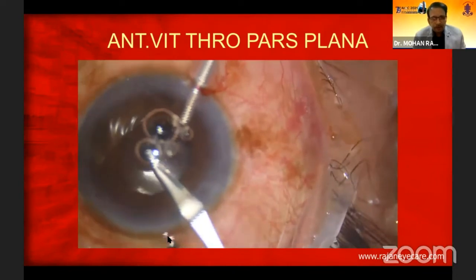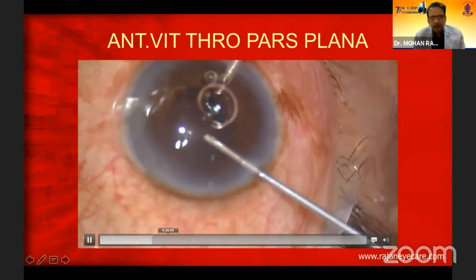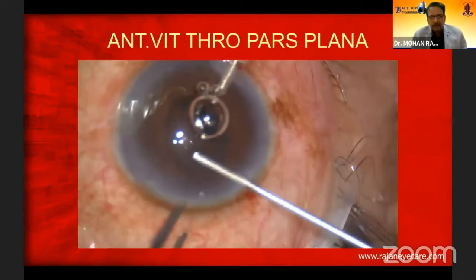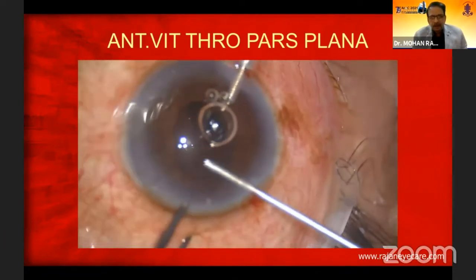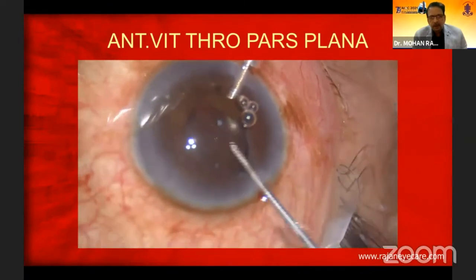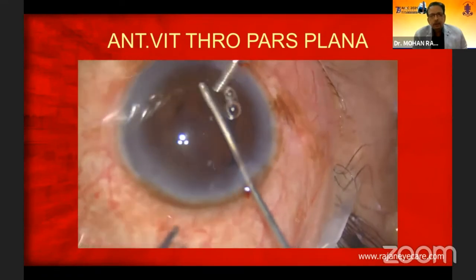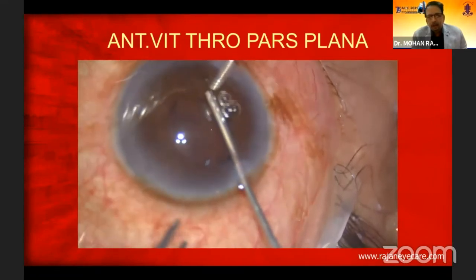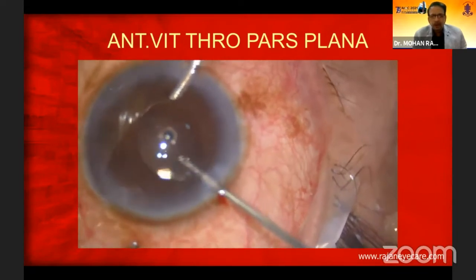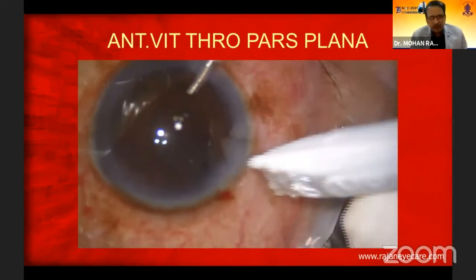I'm removing the vitreous from the anterior chamber, and then I put a trocar and cannula and go inside into the vitreous cavity. You can see I'm removing the vitreous from the anterior chamber, but once I do that, the vitreous is still present in the vitreous cavity. So you can't remove the vitreous from the limbal route totally. You need to go behind and remove the vitreous — you remove less vitreous with less traction on the vitreous base.